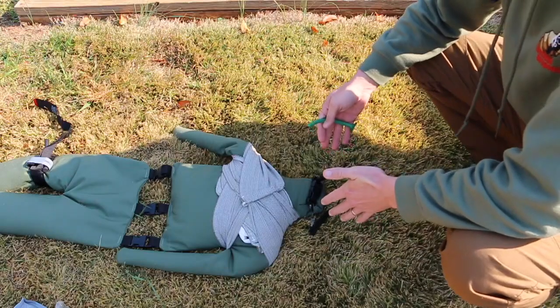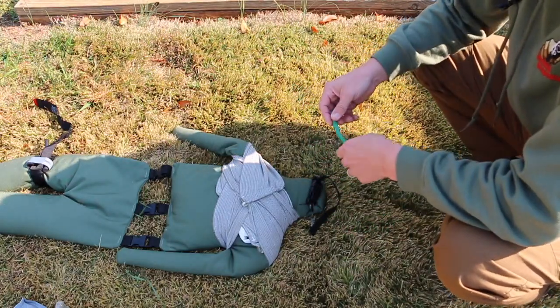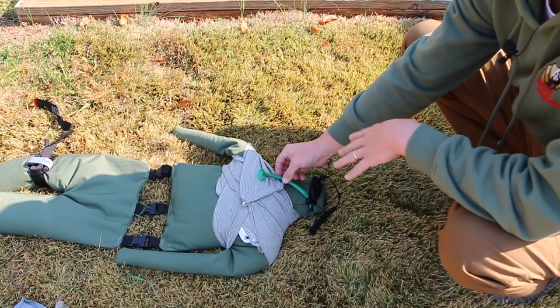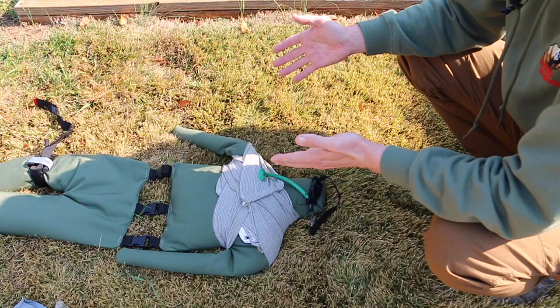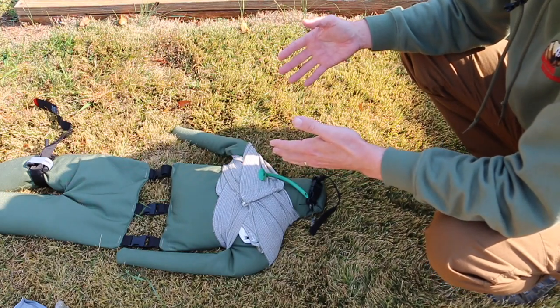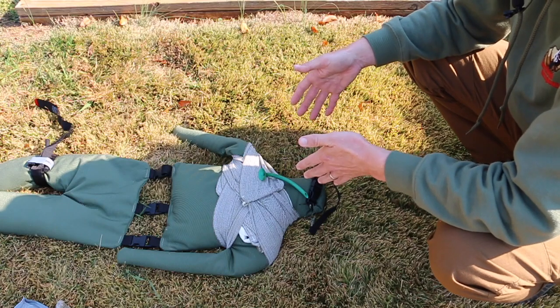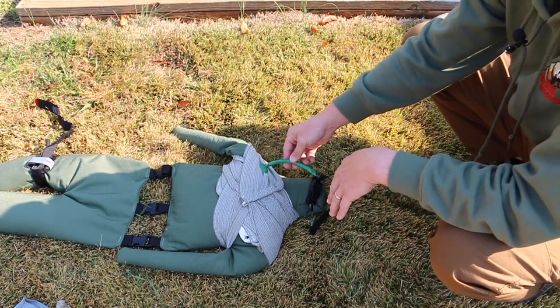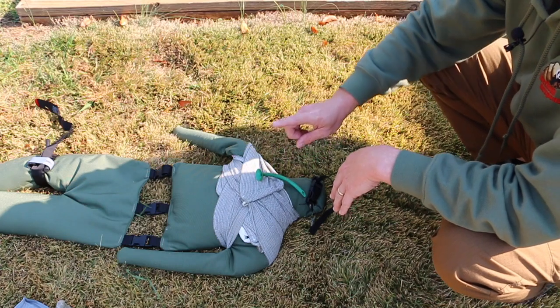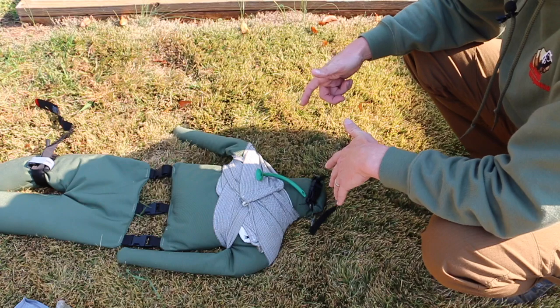So for this portion here, we're gonna have to pretend that my patient has a head, obviously. So this NPA is a number 28. You find it in most of your trauma kits. That's the normal size, the average size for an adult. It goes in to protect someone's airway, meaning that they are unconscious or semi-conscious. And then we can put this, it goes into their nose, goes behind their tongue, misses the gag reflex, which is important, and opens their airway for them, keeps it open.